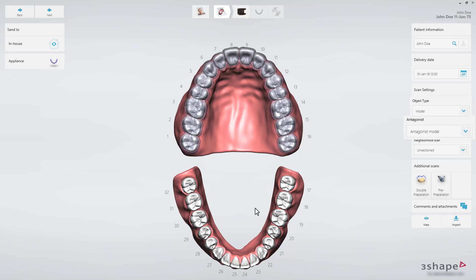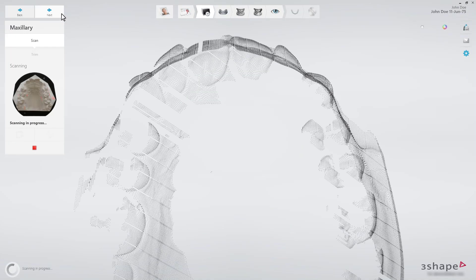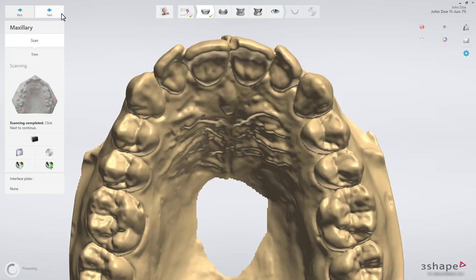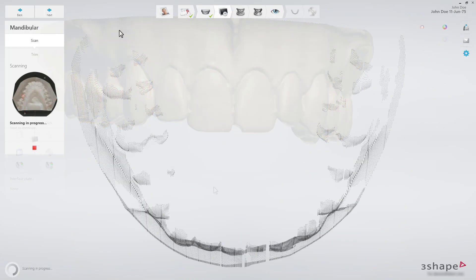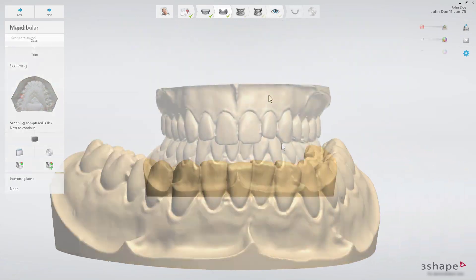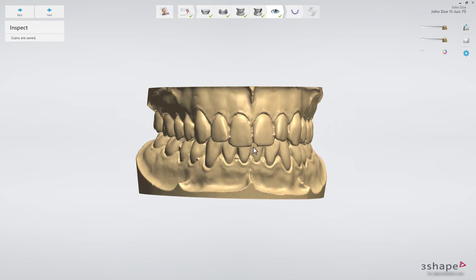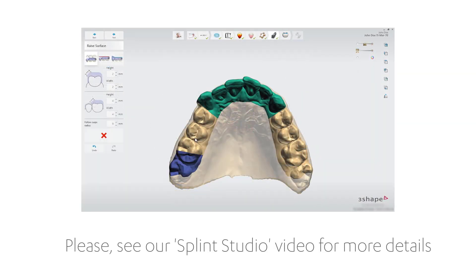Select Model, Antagonist Model, and Unsectioned in the Scan Settings menu. Click Next to start scanning the case. To learn how to design a splint, please watch the video on splint design.